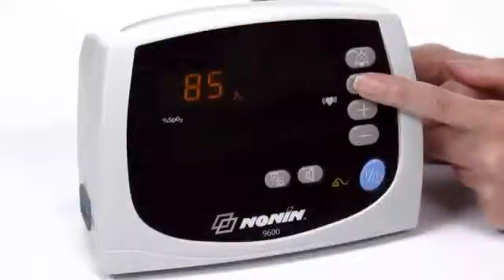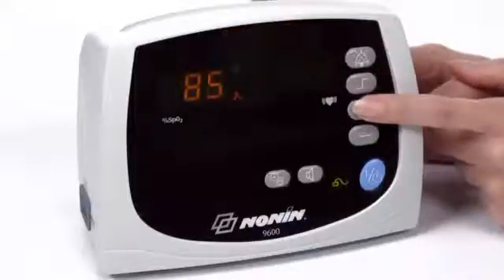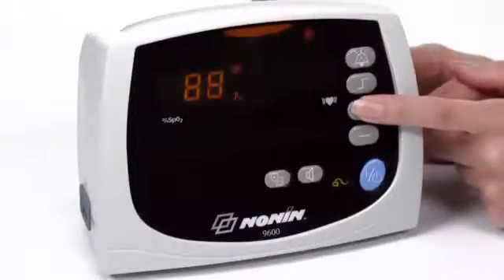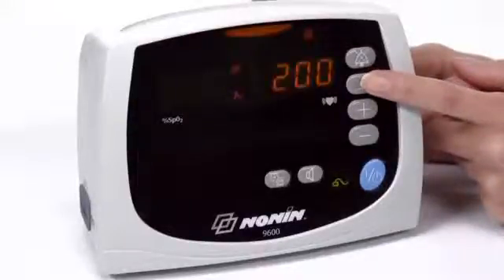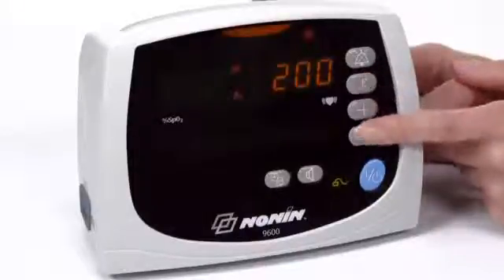Alarm ranges can be customized by pressing the alarm limits button and then using the plus or minus button to scroll to the desired setting for each limit. Alarm limits will return to the default settings when the oximeter is restarted after being turned off.